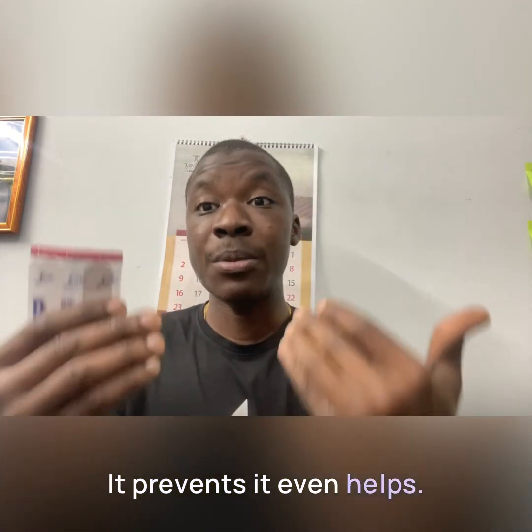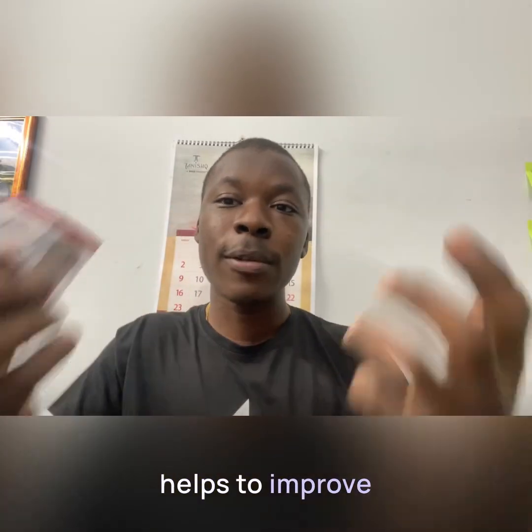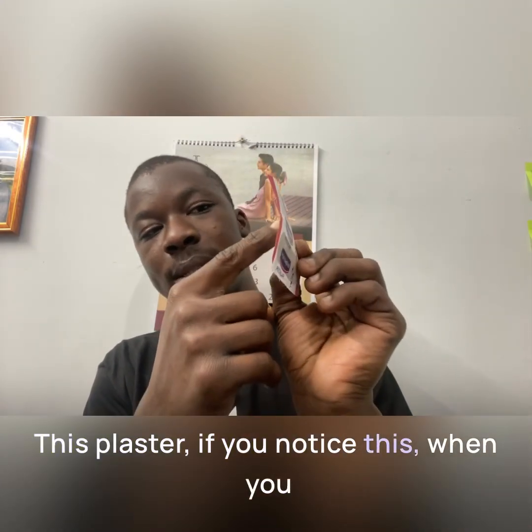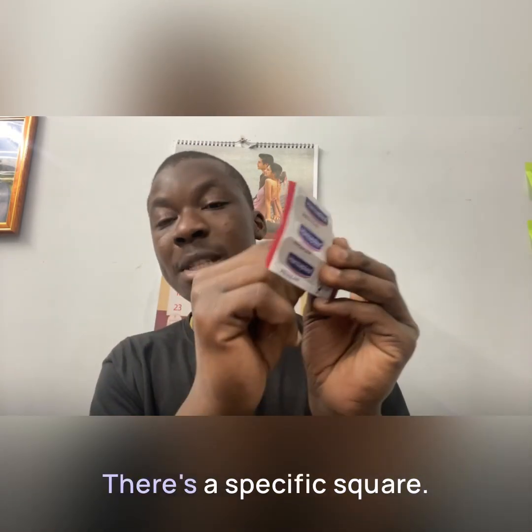It has been proven that plaster helps to improve wound healing. If you have ever used this plaster before, when you open it you'll notice there's a specific square.